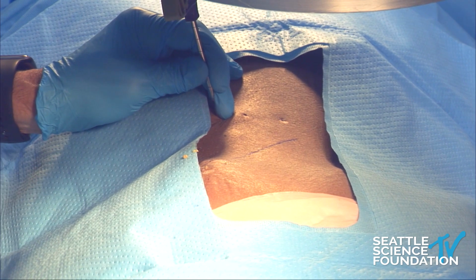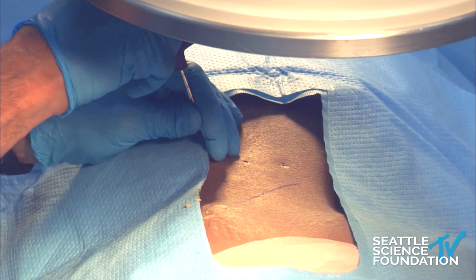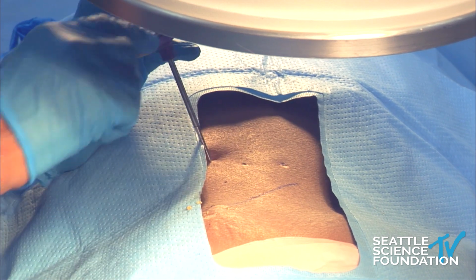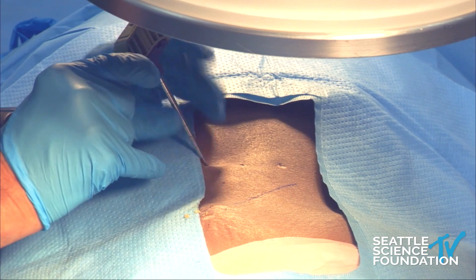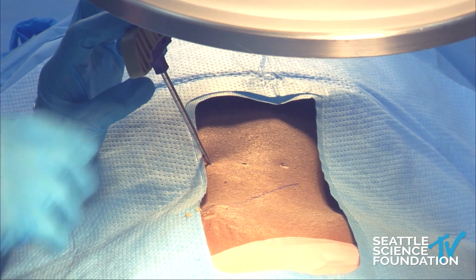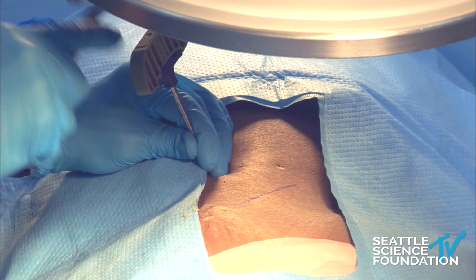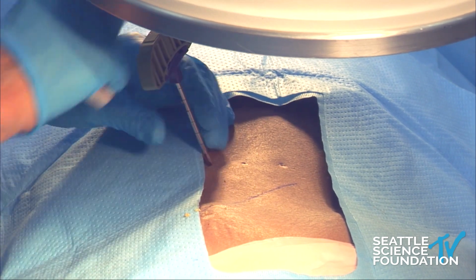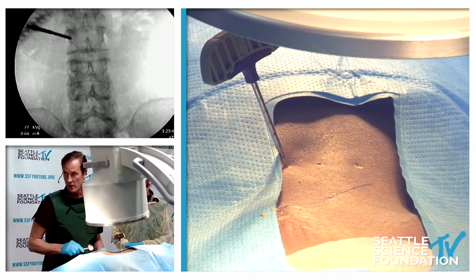The other thing is you have to really make sure and get purchase on the outside of the pedicle. So if you're not getting purchase, you turn the directional point of the needle away, and then you start off like that. So now we're getting purchase, going directly into the pedicle, and we come down.